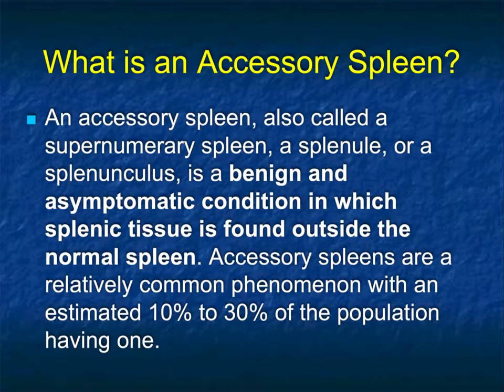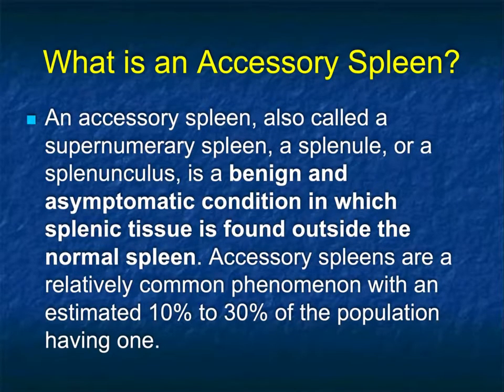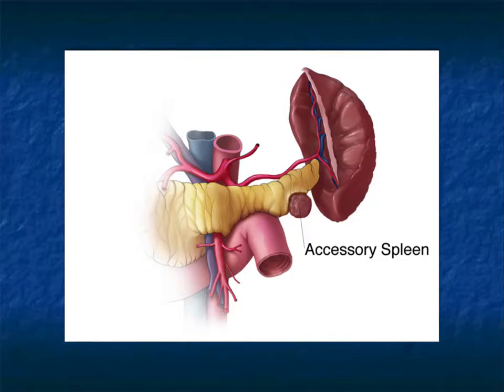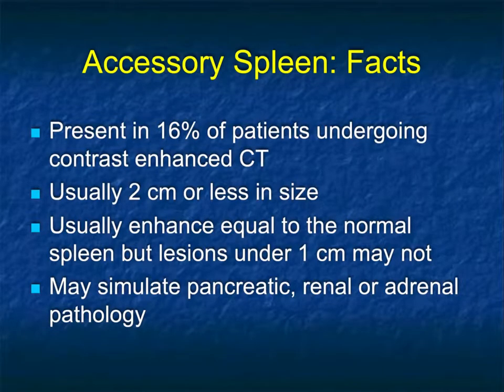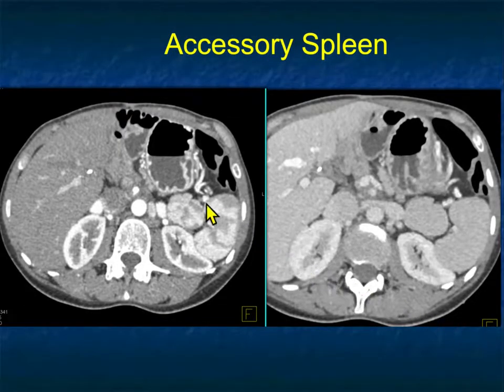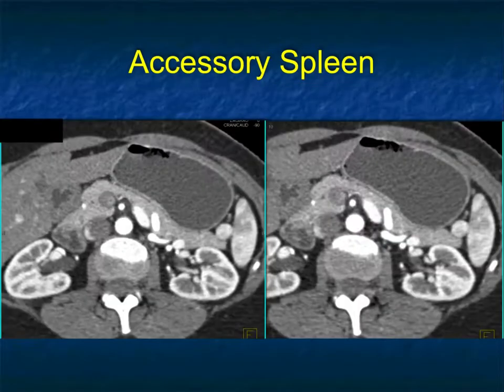Accessory spleens are found in 10 to 30% of the population. Since the accessory spleen enhances, it can look like a pancreatic mass — that's often one of the challenges. Accessory spleens typically enhance like normal splenic tissue and are usually 2 cm or less, enhancing similarly on both arterial and venous phase imaging, but can simulate pancreatic, renal, or adrenal pathology. Here's a nice example of a large accessory spleen near the splenic hilum — look at its moray pattern, just like the native spleen. On venous phase, it washes out as does the spleen — a very classic accessory spleen in the splenic hilum.